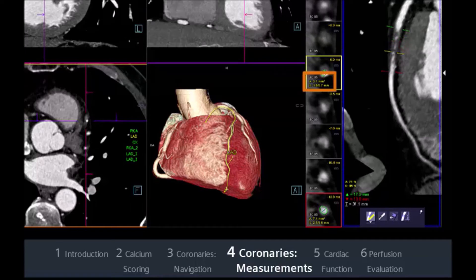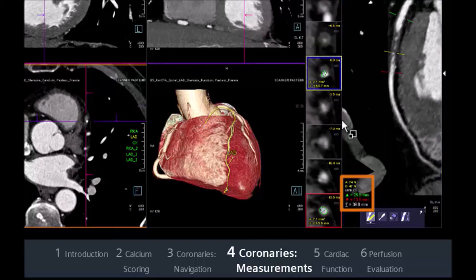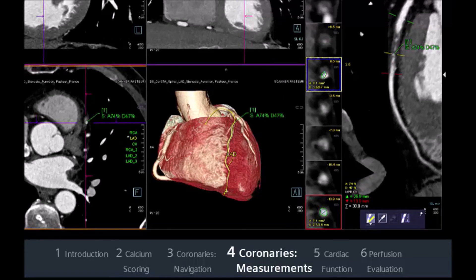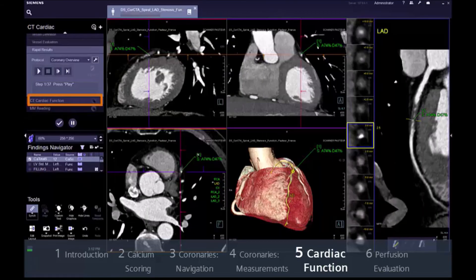The stenosis ratio in the area and diameter, by comparing the lumen on the yellow marker with the lumen on the red and green markers, will help you determine the stent length. Click on the create finding tool if you want to send the measurement to your multi-phase data.